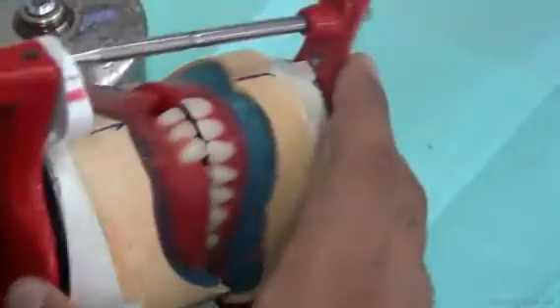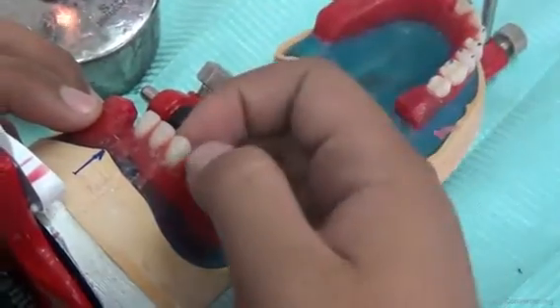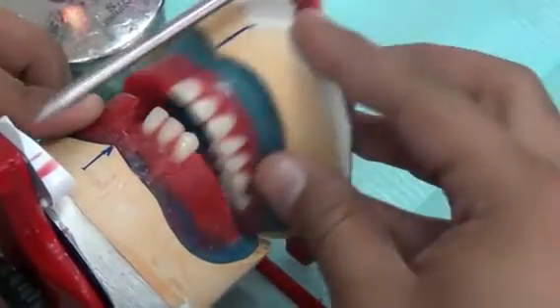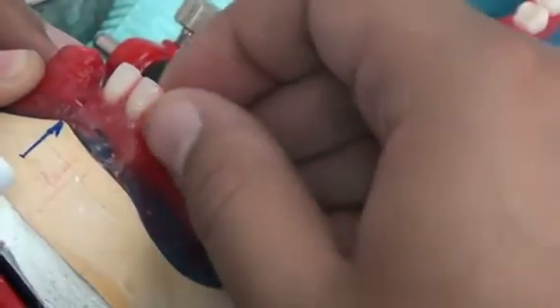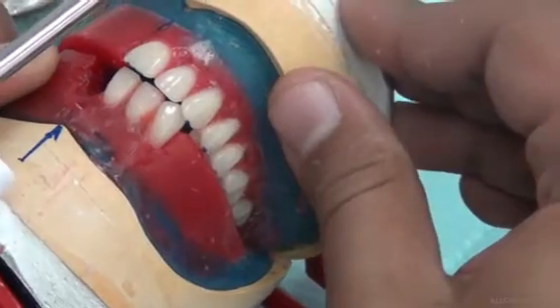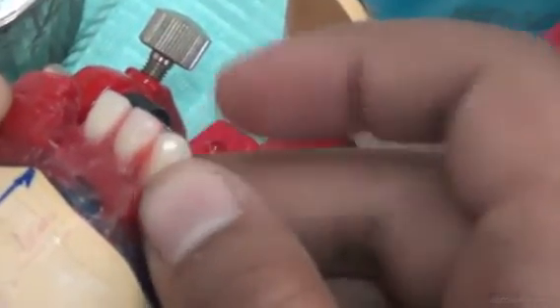So I'm putting the tooth into location and then comparing it with the upper. I should have the same overjet that I had. So if the tooth is touching the upper teeth, I should not have it. Now the lower canine should have the same overjet that the centrals had, the same overbite that the centrals have, and also it should come into location between the lateral and the upper canine position.